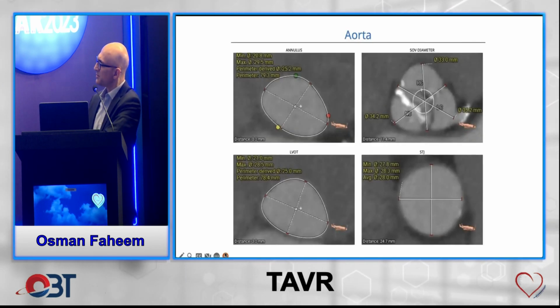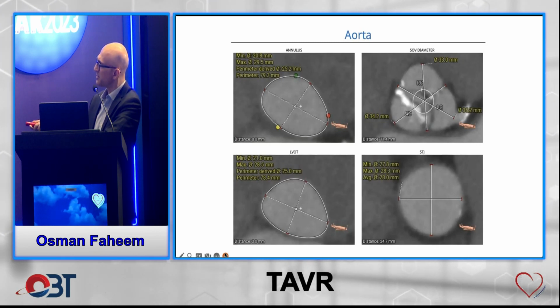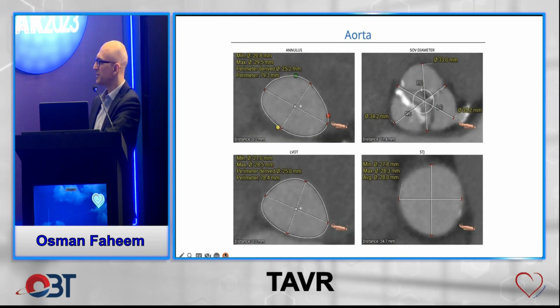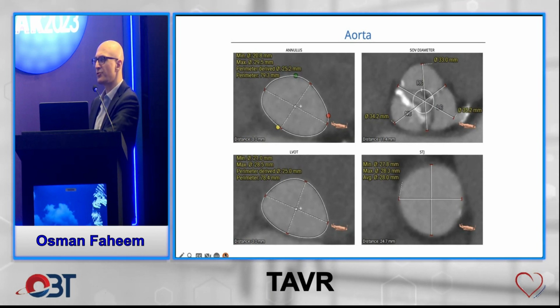So, the other thing you get on the CT report, and which you should be looking at yourself, again, the sinus depth, leaflet calcification. So, Ali, how do you look at leaflet calcium, and do you worry about its distribution? Is it a friend or a foe?